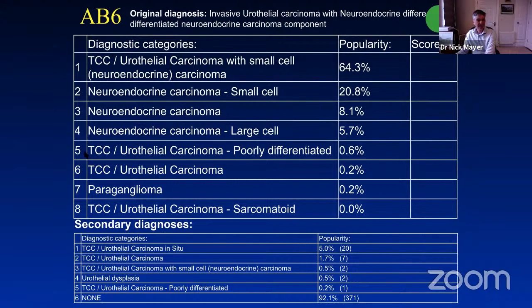And there's a few others, a small number of others. This last one, number 8, I think that must have been a trainee or overseas, because it's got 0 here. So it's really only 5, 6, and 7 that we'll be scoring, and they probably don't merit a mark, given that they haven't picked up the neuroendocrine element to this.